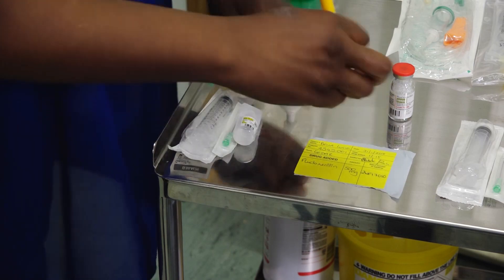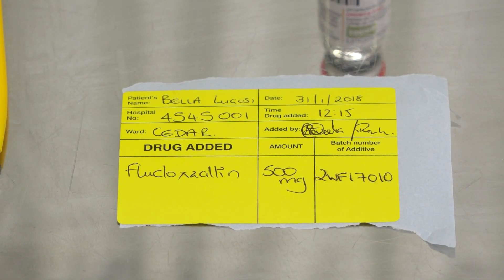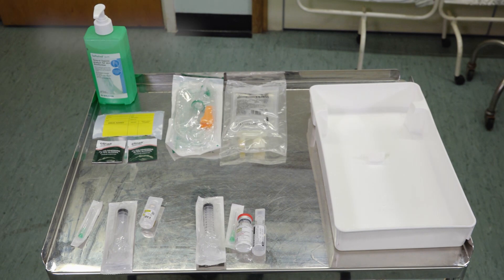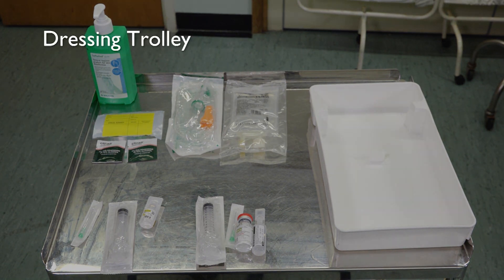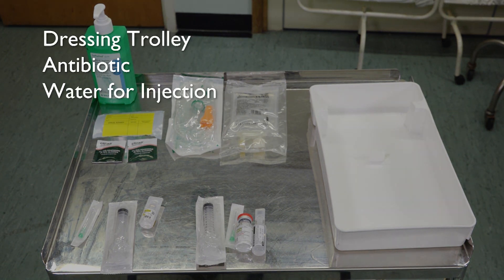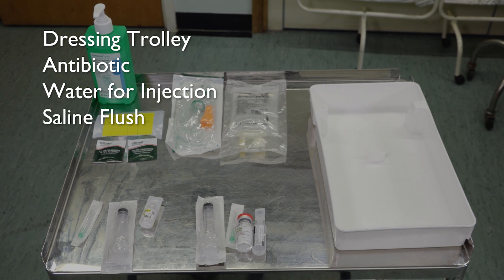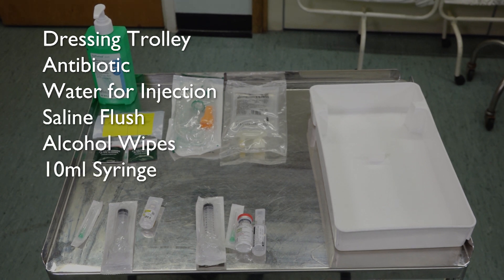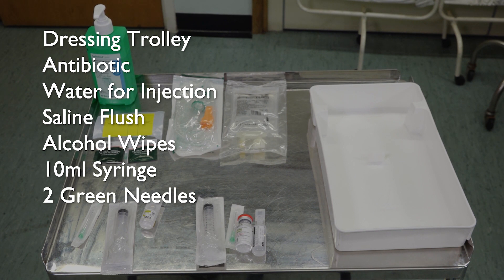Fill in the drug additive label and complete with signatures. You will need a clean dressing trolley, the antibiotic, some water for injection, a saline flush, alcohol wipes, a 10ml syringe and two green needles.